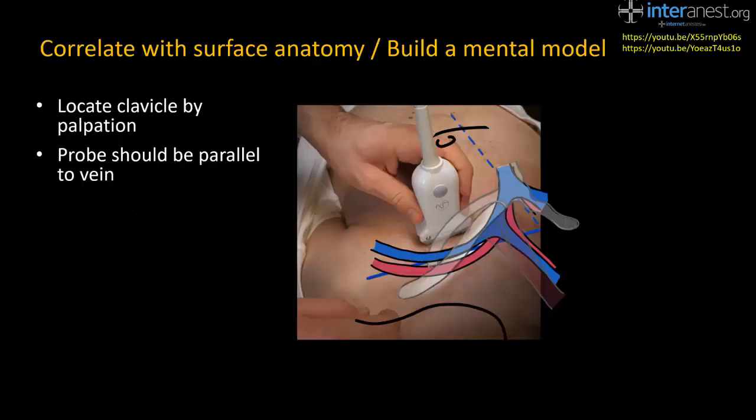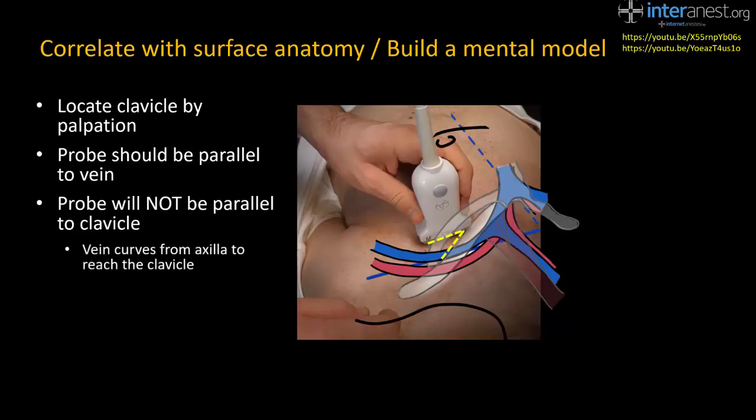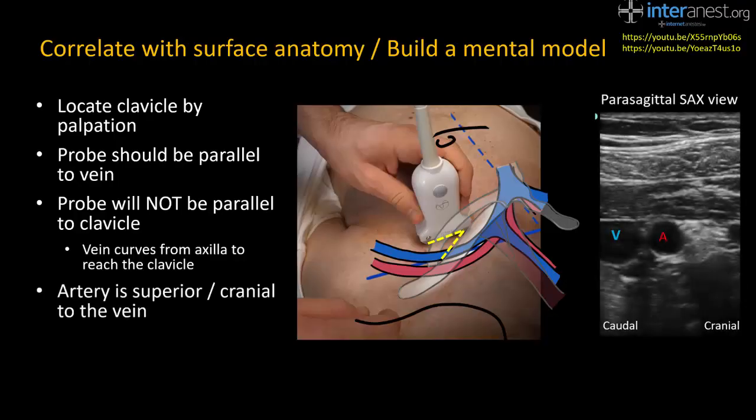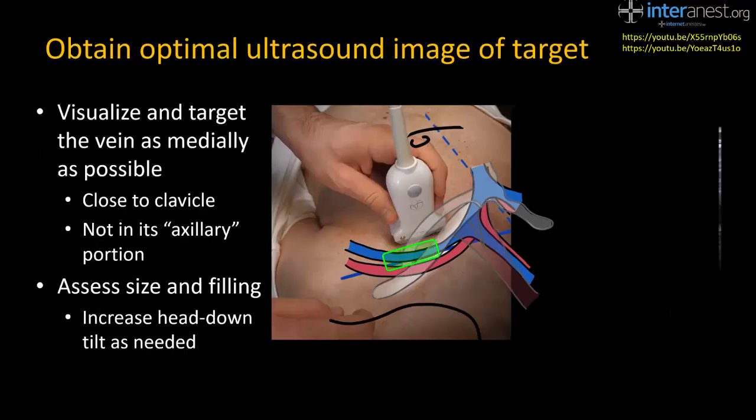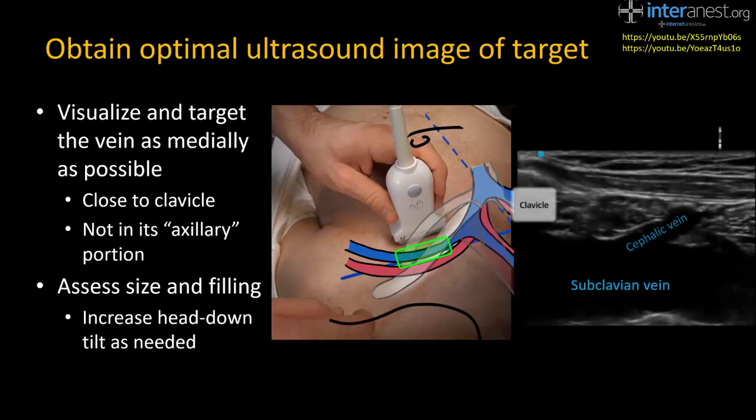As with all ultrasound imaging, it helps to know your anatomy. Use the clavicle as your landmark, and remember that the vein takes a curving course towards the clavicle, so the probe will not be parallel to the clavicle when the beam is parallel to the vein. It's also helpful to know that the artery lies cranial to the vein, so if the probe is tilted to direct the beam cranially, both vessels can be seen simultaneously — though I don't recommend this view when targeting the vein for puncture. Trace the axillary or subclavian vein along its course to visualize its medial portion where it dives under the clavicle and has a relatively superficial and straight course. Note that you will often see the cephalic vein joining the subclavian vein at this location close to the clavicle.